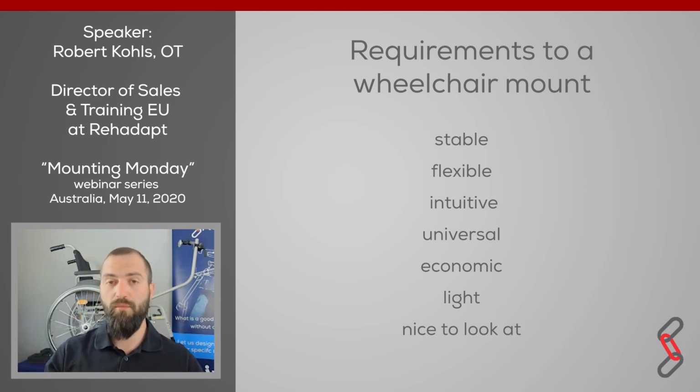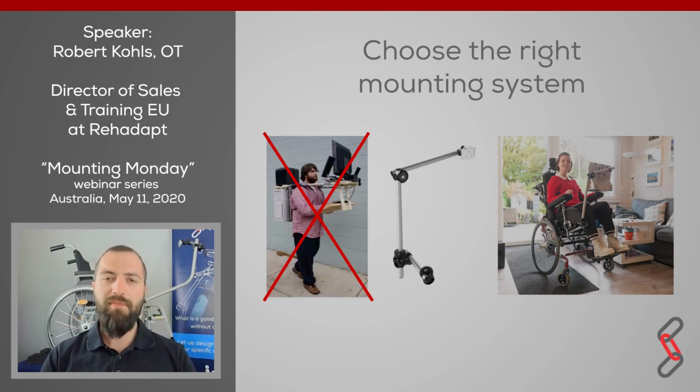And also when we are working with kids, with very, very light kids, we also don't want the wheelchair, the mount, and the communication system to fall over to the side when the customer is sitting in. And it should also possibly be nice to look at, because otherwise it will stigmatize the person even more. So for the people that have joined our last meetings, that slide may look a little bit familiar. This is not how we think mounting of AAC devices, and especially of eye gaze devices, will work well.